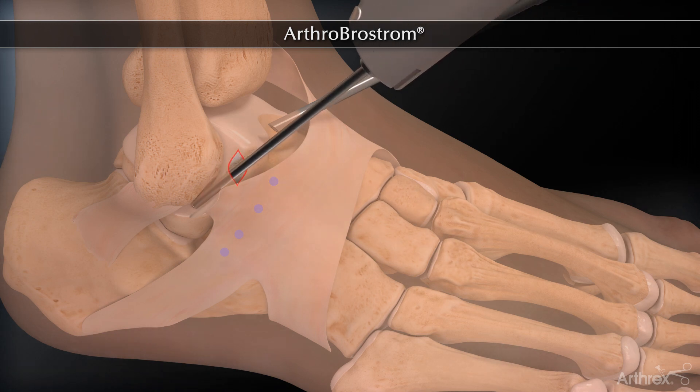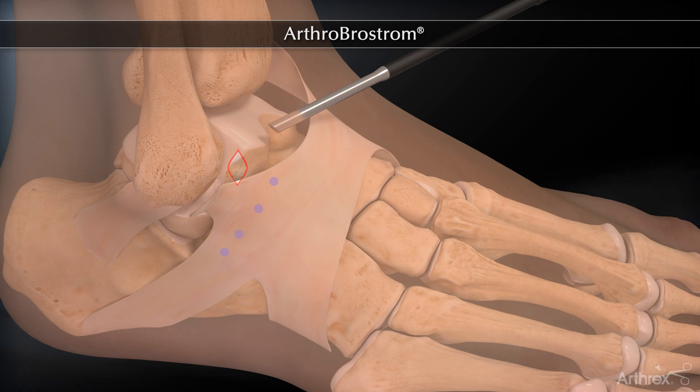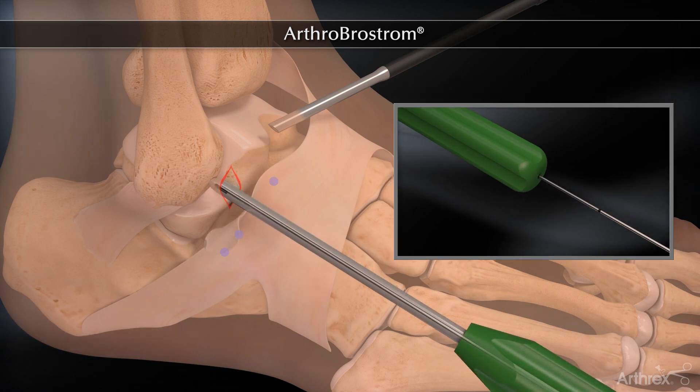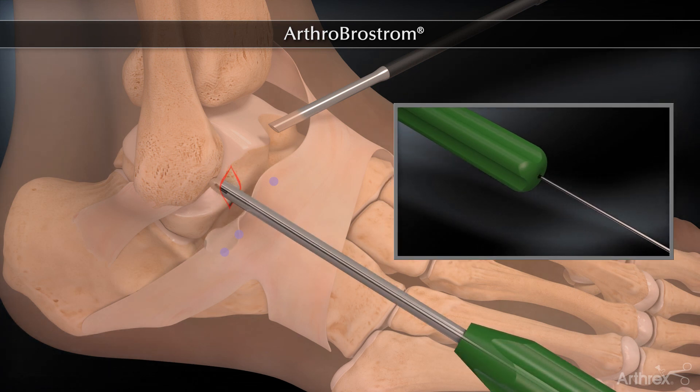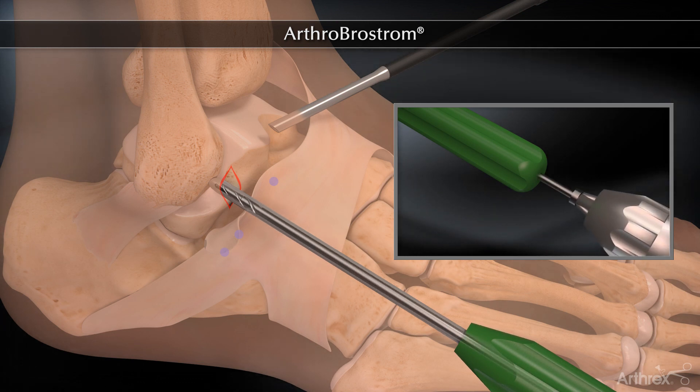Debridement of the lateral gutter is performed using an arthroscopic shaver. The site of the first anchor is located 1 cm proximal to the distal tip of the fibula. The preloaded 3.0 mm biocomposite suture tack anchor is pre-drilled and inserted through the guide.